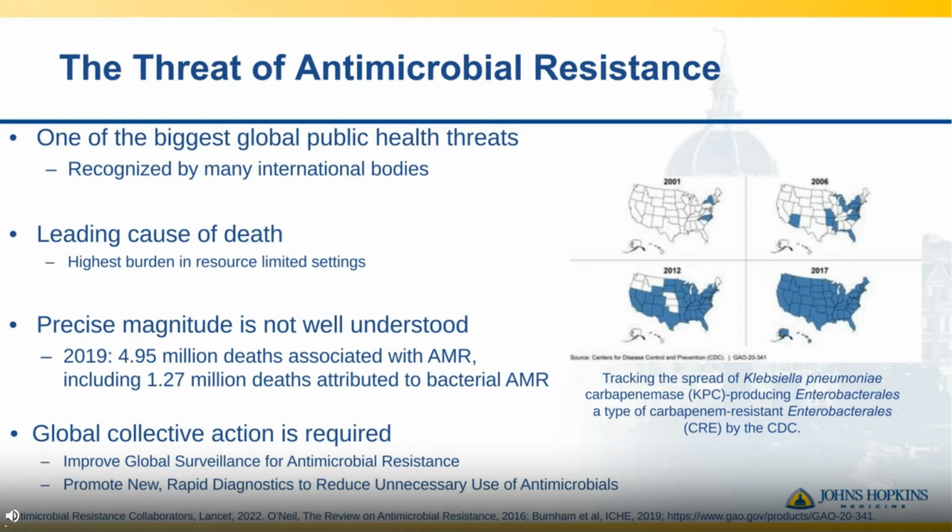And two of the initiatives that have been described to address the threat of antimicrobial resistance include improving global surveillance for antimicrobial resistance and promoting new rapid diagnostics to reduce unnecessary use of antimicrobials, both of which can be addressed through whole genome sequencing applications, which I will discuss throughout my presentation.